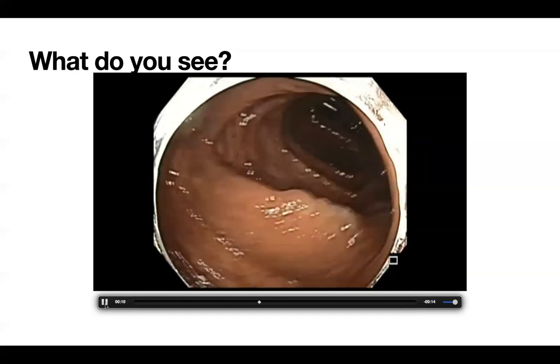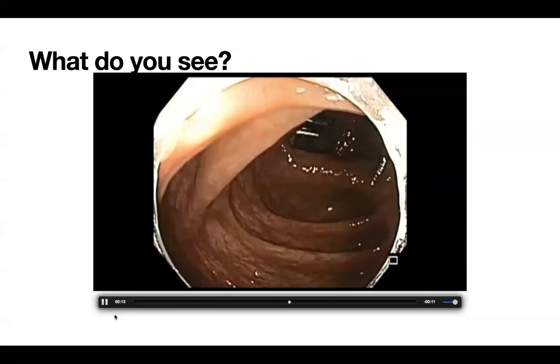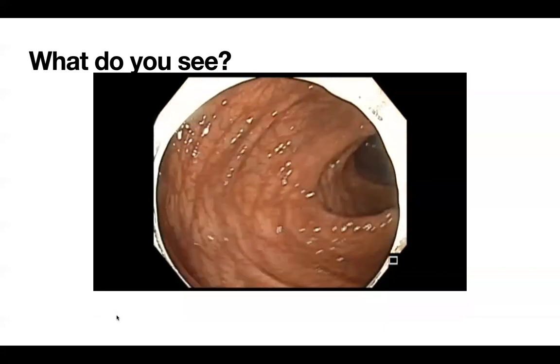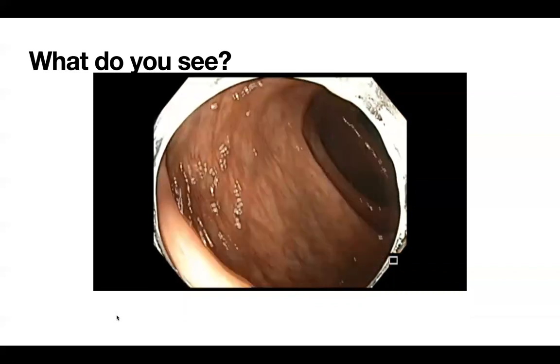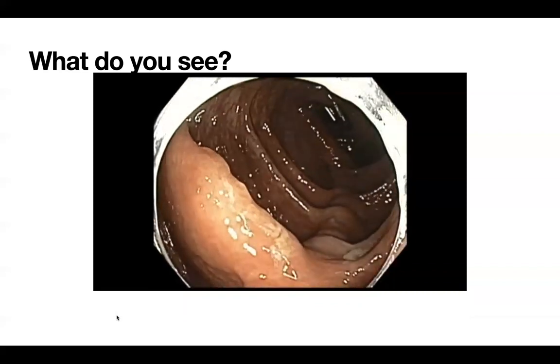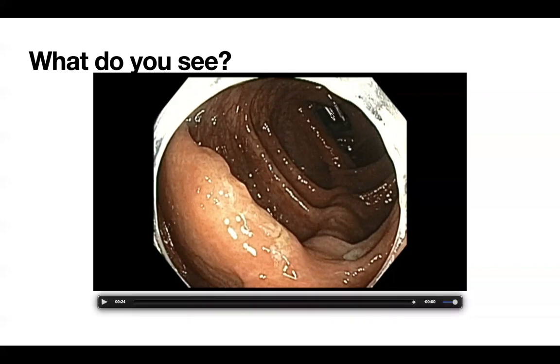It looks about 18 to 20 millimeters in size, and there's some mucus stuck on the opposite side of this polyp. Whether that is also another small polyp or not can be decided once this is taken care of. Of course, saline injection, and if possible, one piece resection. Thank you. I want you guys to look at these clips here. I want to focus on this polyp, and then we'll talk about it towards the end of the session.